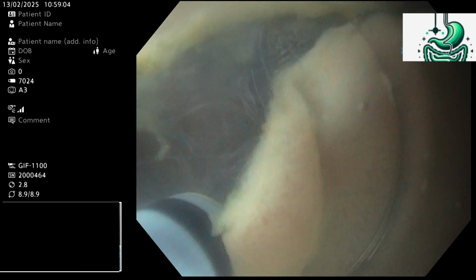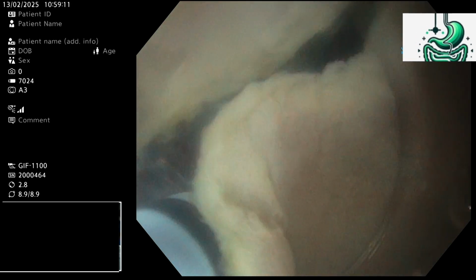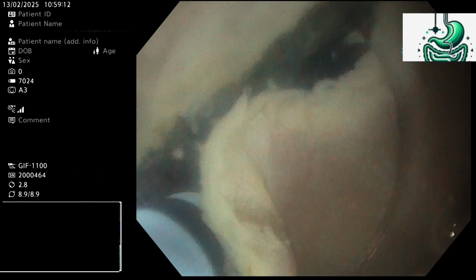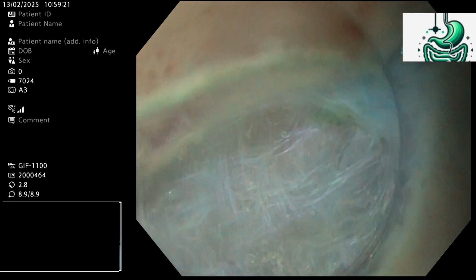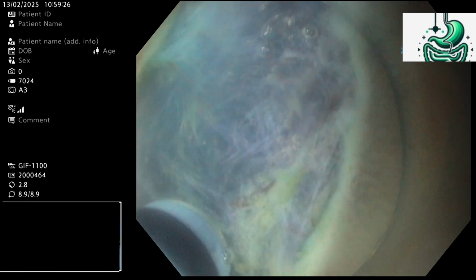I think all these strategies and techniques come from the pocket creation method. The concept of the pocket creation method is to have a non-circumferential incision and to have good access to the submucosa, as we're doing now. So now we're trying to do saline immersion, it seems. Yes, well, we try to combine all this.